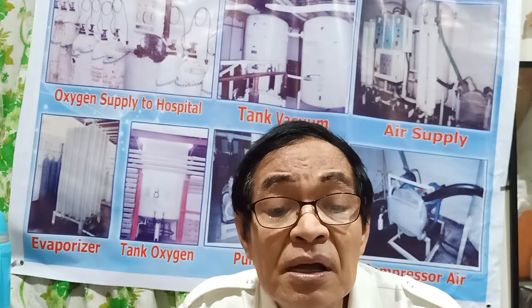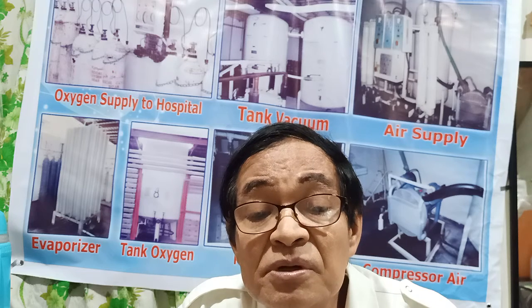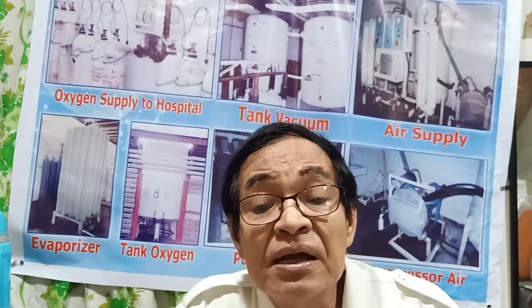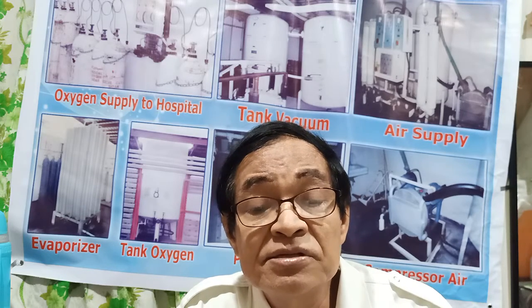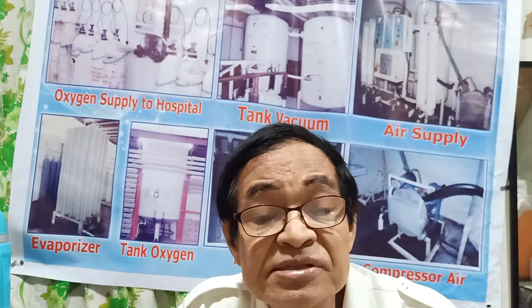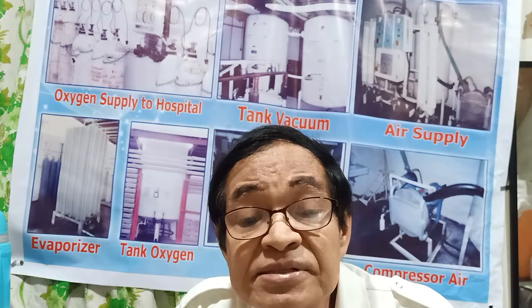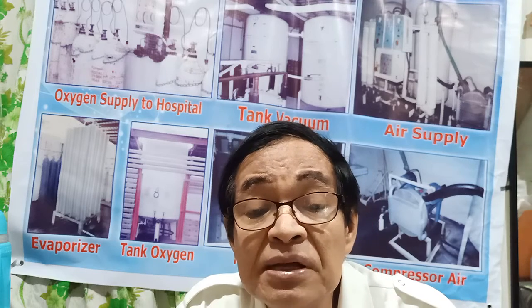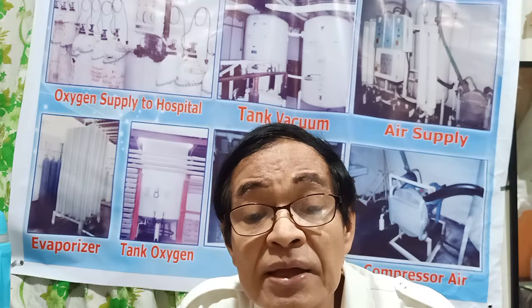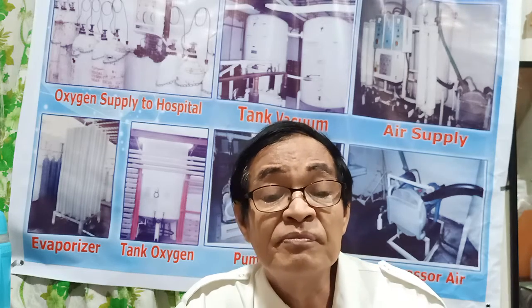Freestanding cylinders are connected to the piping supply through a model of the manifold, the MCS2 manifold control system. A Medical gas central alarm panel monitors the medical supply at each MCS2 manifold.